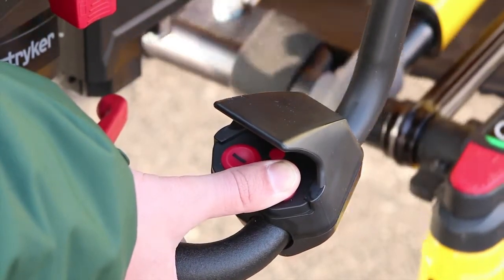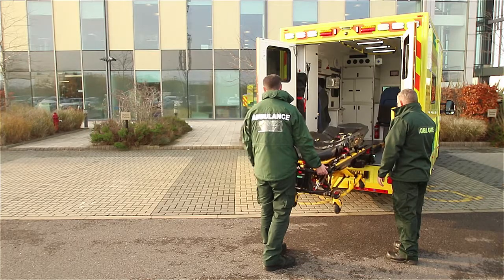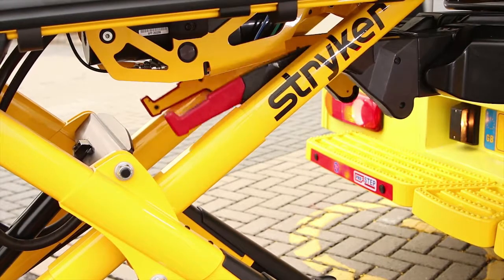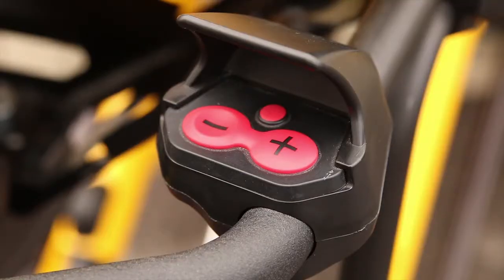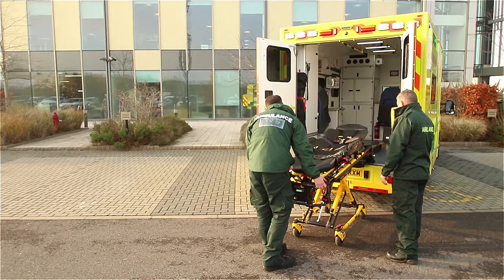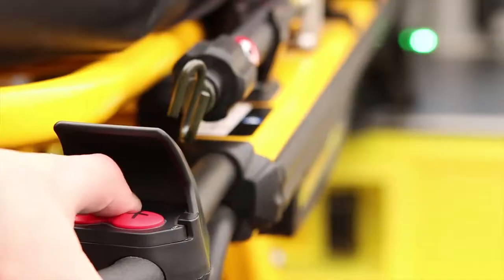Press and hold the plus button until the stretcher wheels are on the ground. The first sound you hear is the stretcher legs extending; the second sound is the lifting arms lowering. The lifting arms will continue moving downwards until fully lowered. The foot-end operator will then press the small red button on the stretcher control panel to unlock the stretcher and safely remove the PowerPro XT from the PowerLoad system.